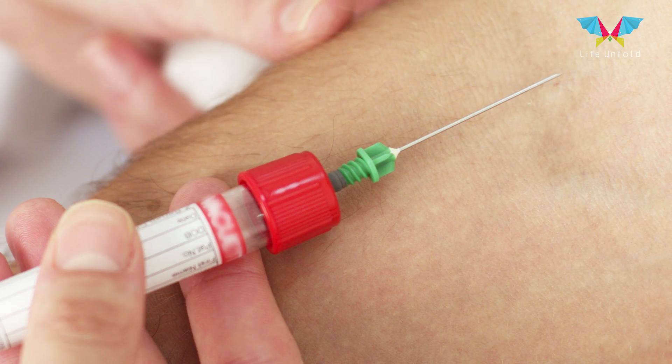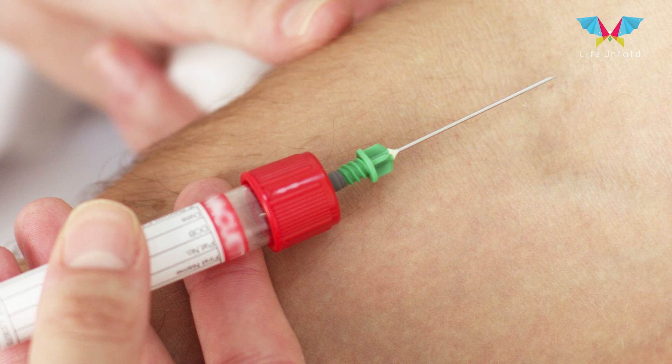In angiography, there is not much patient inconvenience. A slight prick of the needle is felt. After that, everything locally is anesthetized. After that, the wire is introduced through the needle and the patient doesn't feel much pain about it.